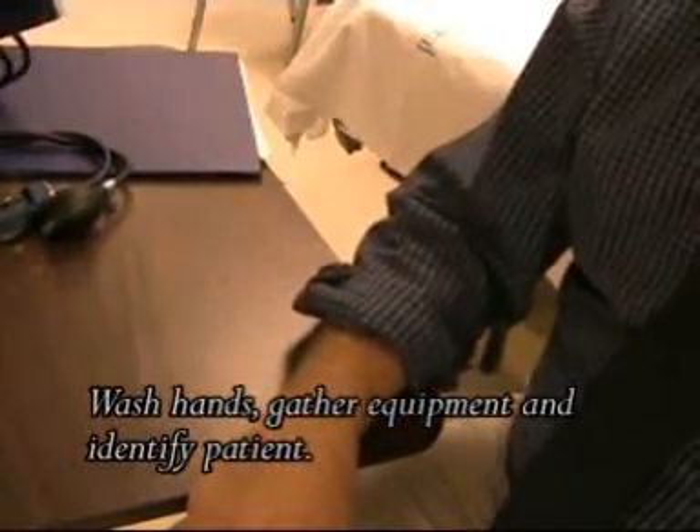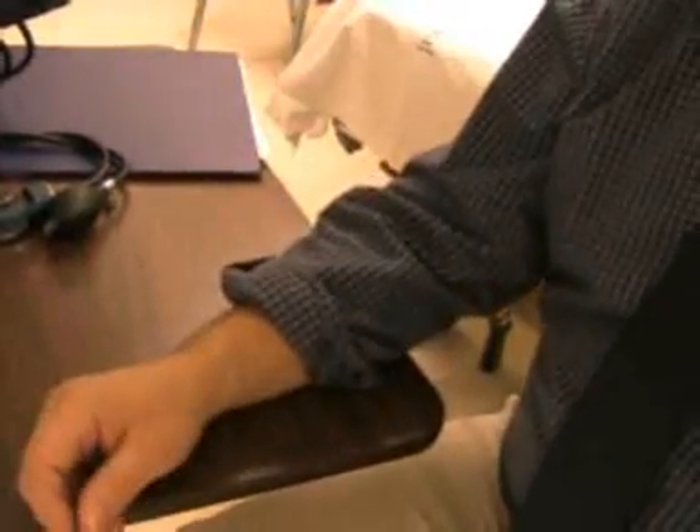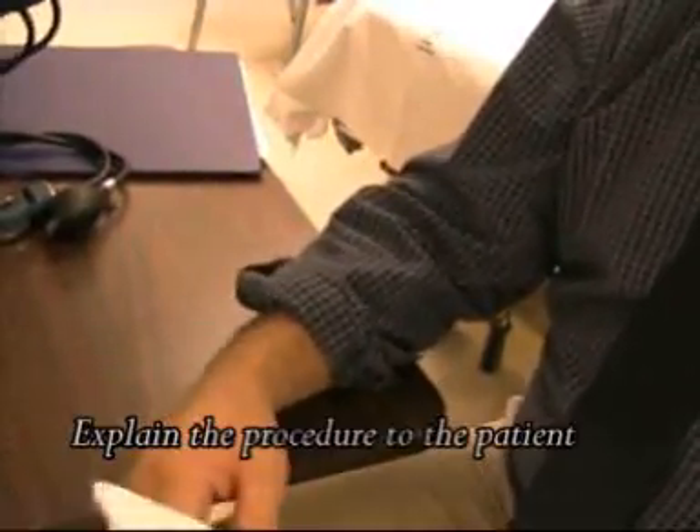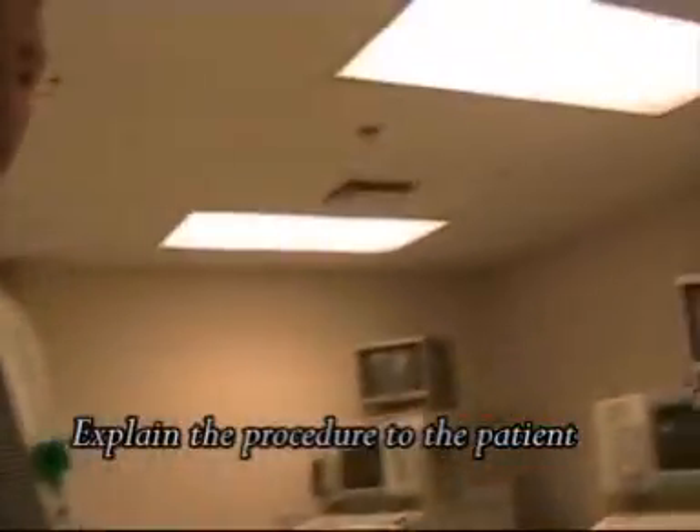After washing your hands and identifying the patient, explain the procedure to the patient. 'Sir, my name is Jim from Respiratory Care Department. We're going to take your blood pressure here this afternoon. Just going to roll your sleeve up, put the cuff around the top of your right arm, right around your elbow. You'll feel it getting tighter. As we're taking the reading, it'll gradually get lower. The pressure will get lower as we get the reading, and then we'll take the cuff off when we're finished.'